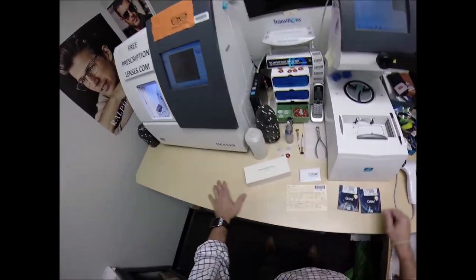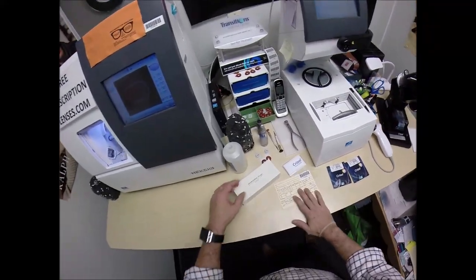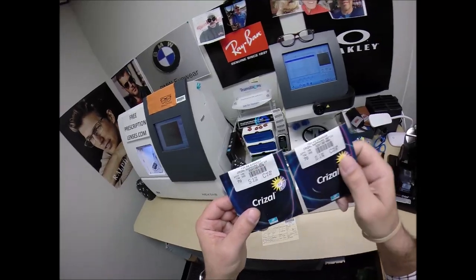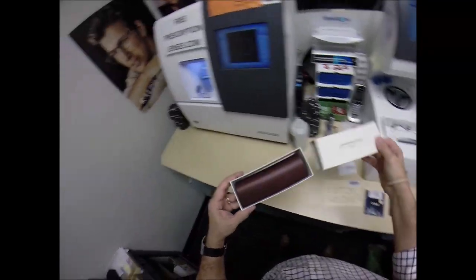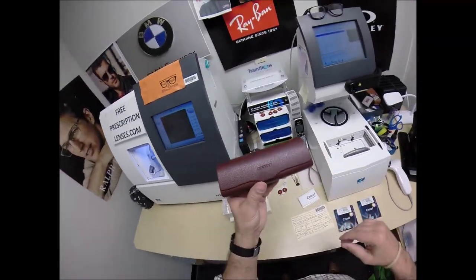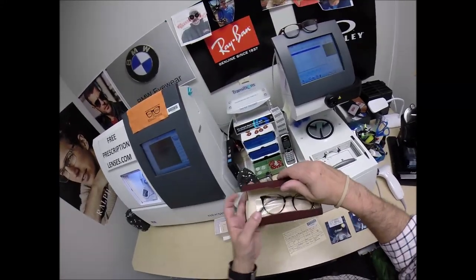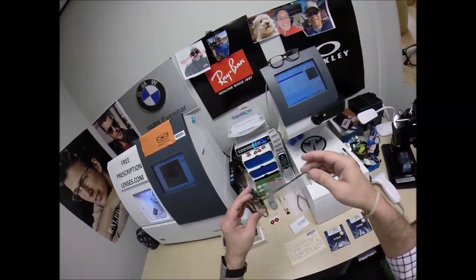Best optical shop in this medical complex that I'm in. Tonight I am going to cut your prescription Crizal Sapphire 360 UV lenses for your Oliver Peoples vintage. Let me take everything out of the original packaging that you have mailed to me. I am not an Oliver Peoples dealer, so he has mailed me this frame — a very nice frame. Oliver Peoples makes some really nice stuff.